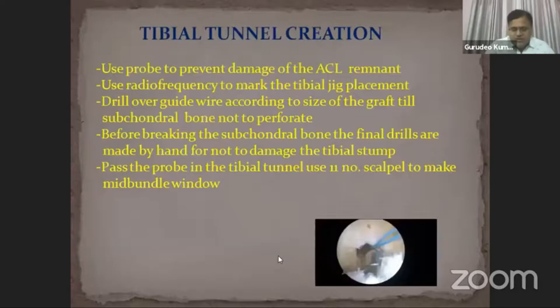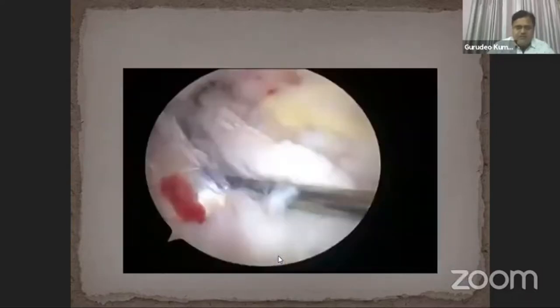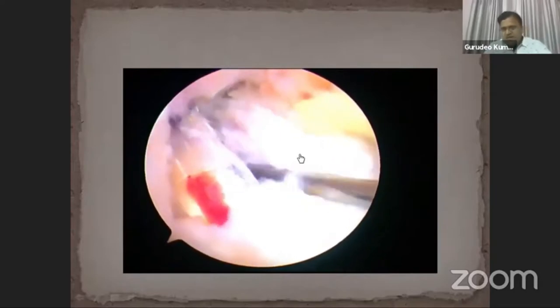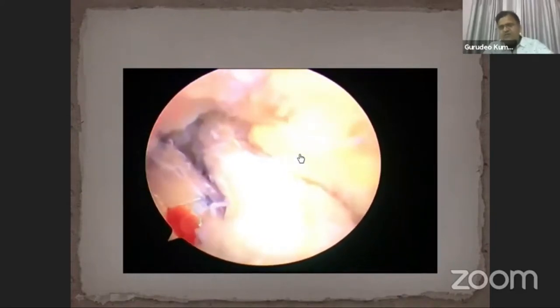This is the final picture showing both the tibial and femoral tunnels. For graft preparation and fixation, we used a semitendinosus quadruple graft, with femoral fixation using a continuous loop endobutton and tibial fixation with an interference bio-screw two sizes larger than the graft diameter. You can see the tension on the graft — it is well tensed — and how nicely the remnant fiber covers the newly reconstructed ACL from tibia to femur.